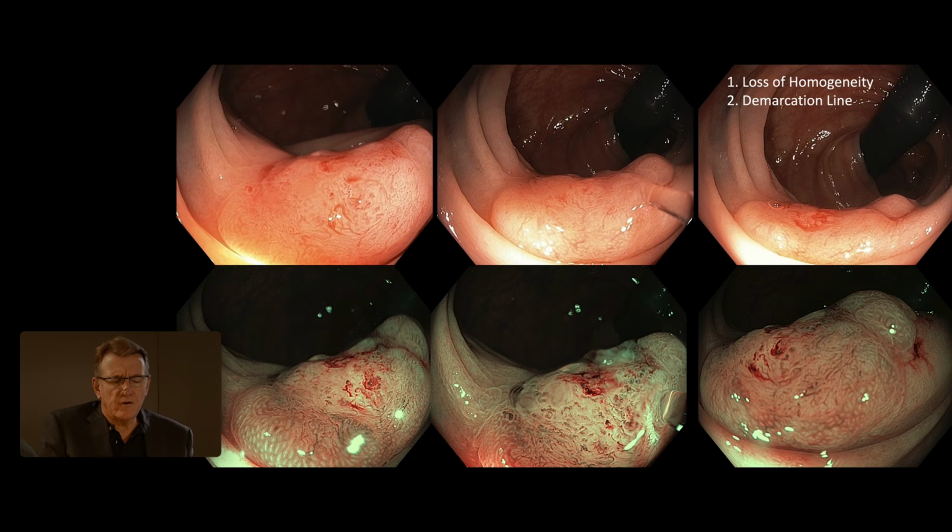I think we should reinforce the tattooing message: not into the lesion, because if the primary assessment was wrong and it could be endoscopically resectable, then you make life much more difficult if you tattoo underneath the lesion. Yeah, that's a common mistake, by the way. Very common. We don't see so many cases referred to us with tattoos, because I've been a bit anti-tattoo unless the patient's going for surgery.